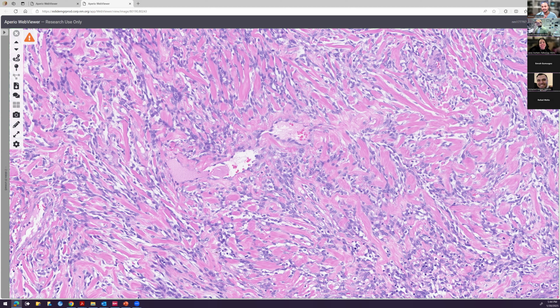So we're coming back to this. Okay, so the answer is every single tumor under the sun could have staghorn vessels. Unfortunately, when I was a resident, we used to learn this. When I was a first year, we'd have a short list of like six tumors that would have staghorn vessels, and then every year that I went up as second, third, fourth year, we'd add tumors to it essentially.